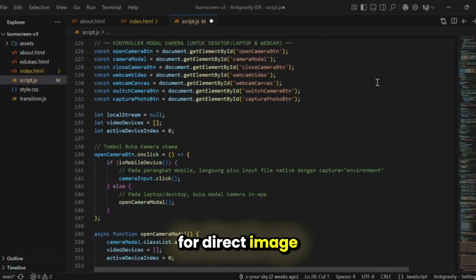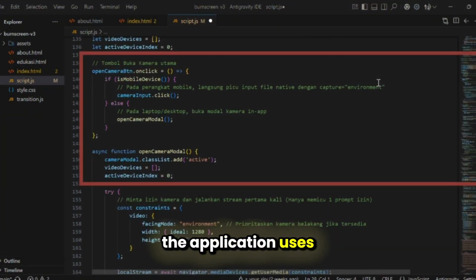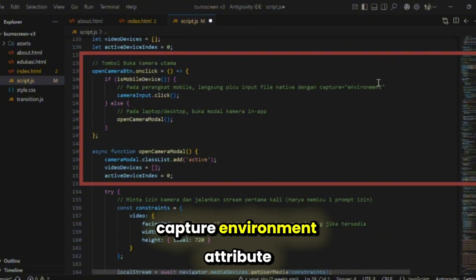For direct image capture, the application uses the isMobileDevice function to determine the user's device type. If the user is accessing the website from a smartphone, the native camera interface is launched through the HTML capture environment attribute.